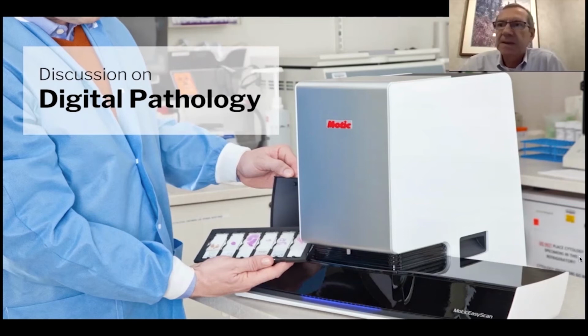So by being able to do that remotely, it not only benefits the patient and the hospitals, since they don't have to keep the patient extra time there, it also benefits our group by being able to be present in places that otherwise would require traveling and scheduling and things like that.